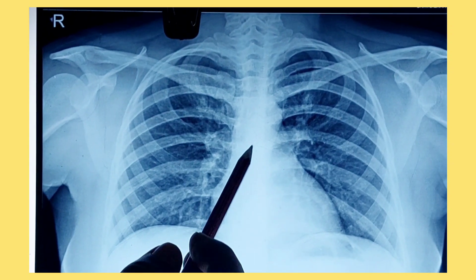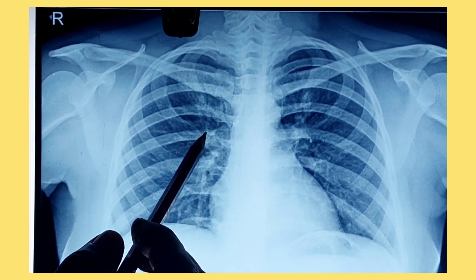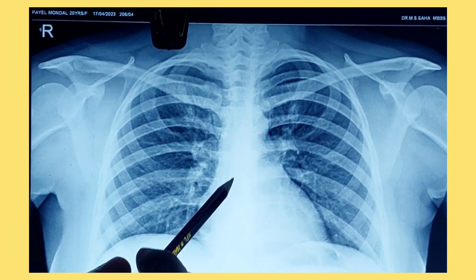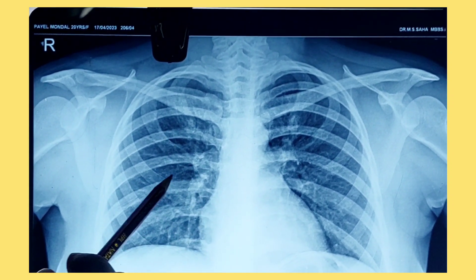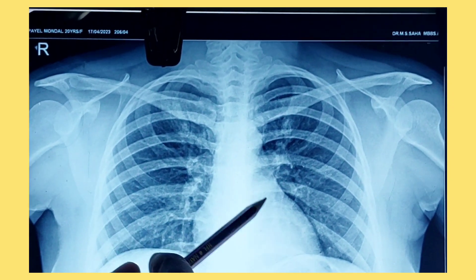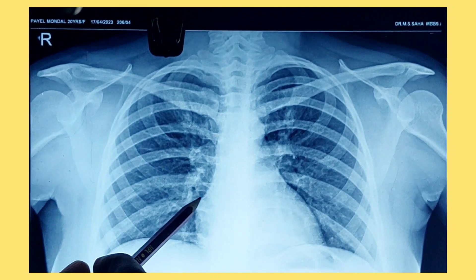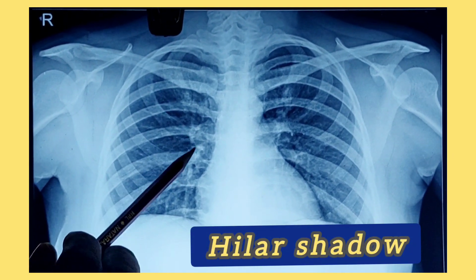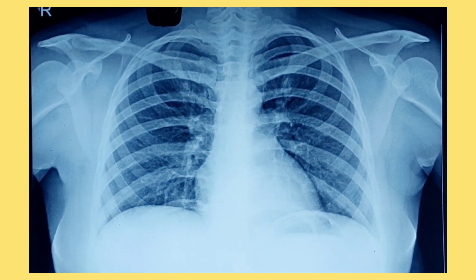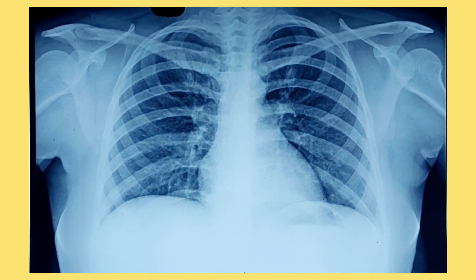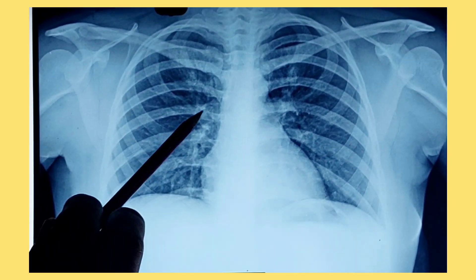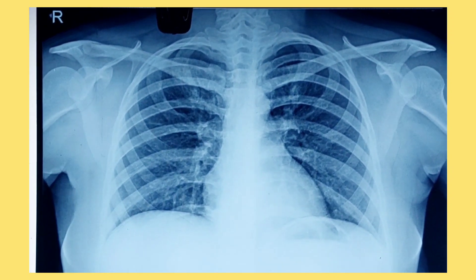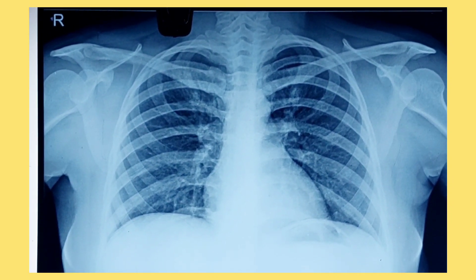Here in this area there are some radiopaque areas visible. Towards the medial side, towards the heart on both sides, that shadow is the hilar shadow. That shadow is due to the lymphatics, blood vessels, hilar lymph nodes, and possibly branches of the bronchial tree.